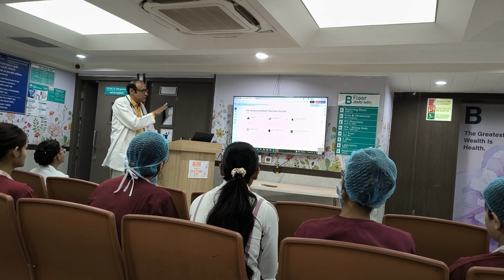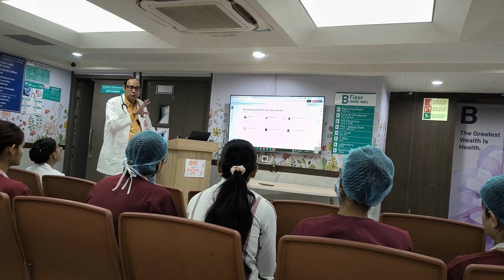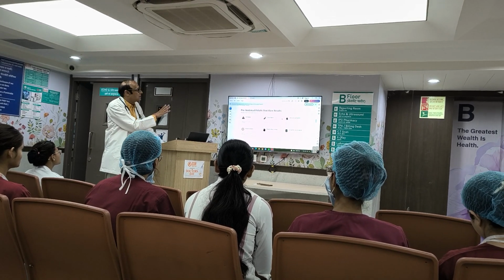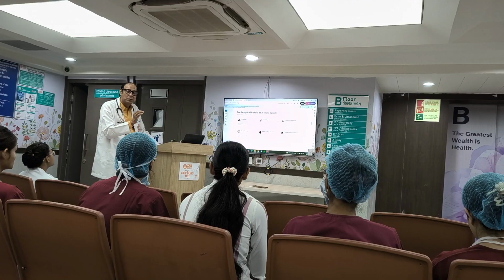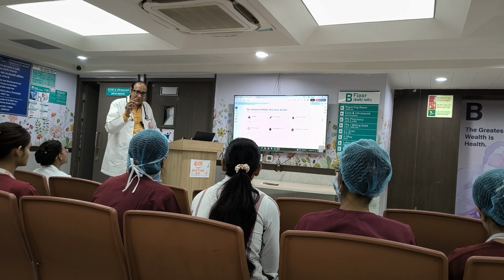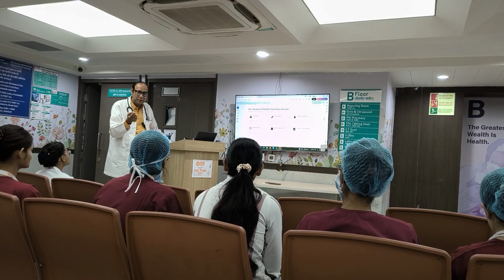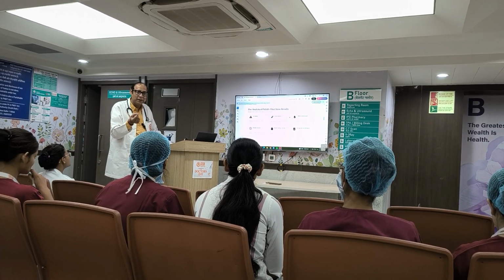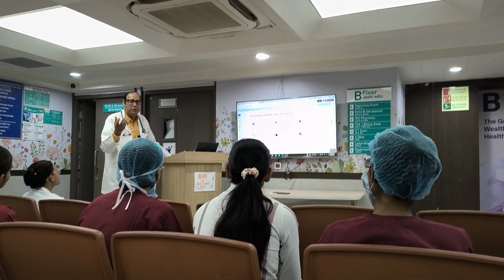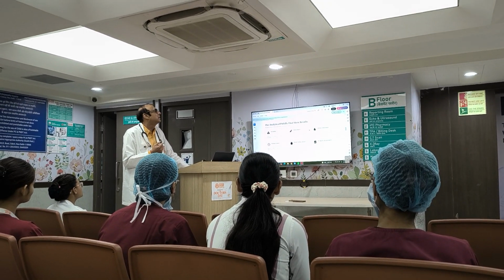So ये जो चीज़ है ना, ये आपके जो रिपोर्ट है उसको चेंज कर देगा. ओके, ये जितना चीज़ है ना, जैसे कि इसके अंदर एयर बबल रहेगा, तो जब ब्लड में ऑक्सीजन रहेगा तो PO2 is going to increase in your sample. अभी जो एक्सप्लेन किया कि अगर ब्लड के अंदर PO2 है, ऑक्सीजन है, तो the result will be in error, it's not a correct result.